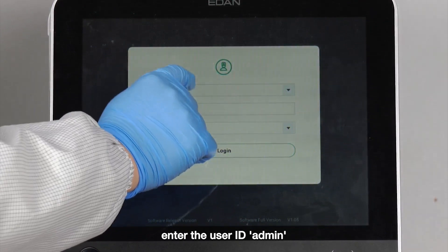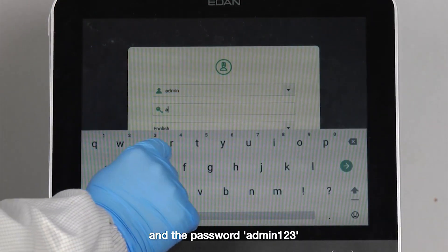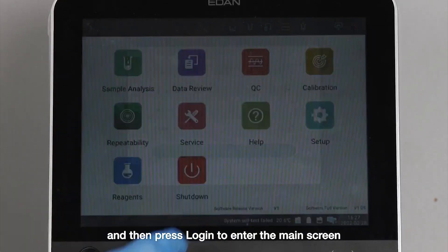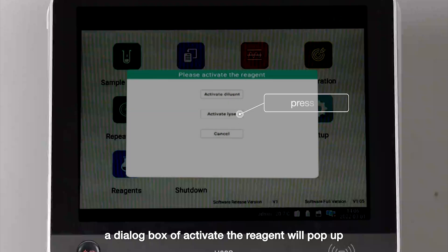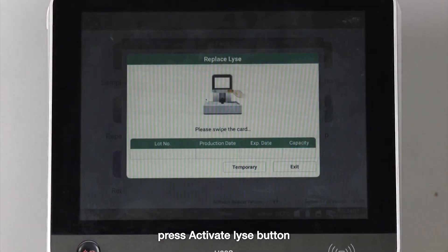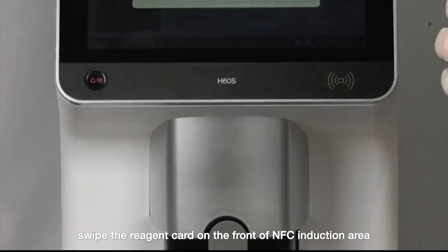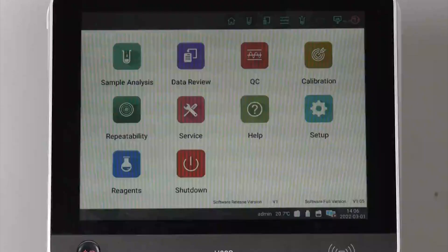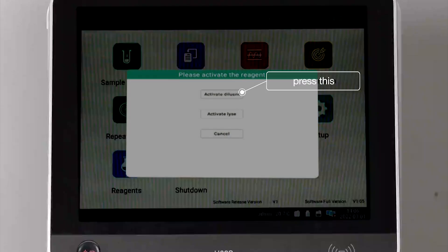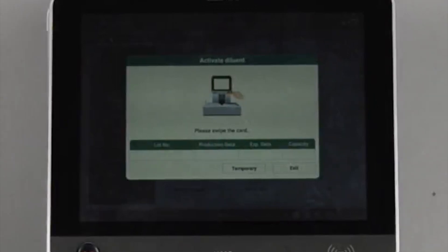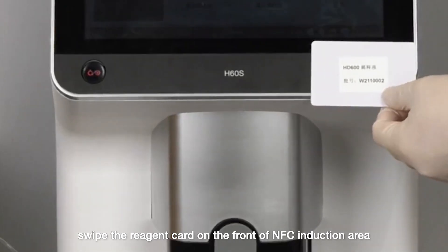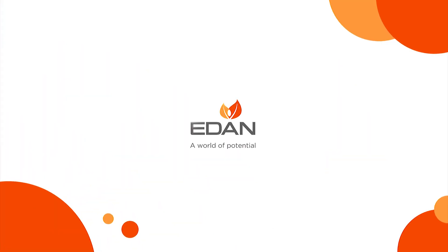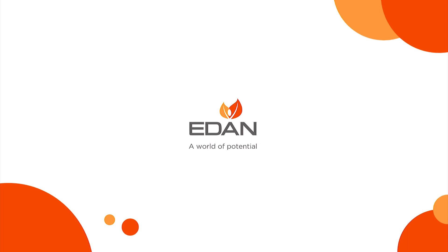Enter the user ID 'admin' and password 'admin123', then press login to enter the main screen. A dialog box to activate the reagent will pop up. Press the activate lyse button, swipe the reagent card on the front NFC induction area, and press start to prime lyse. Then press the activate diluent button, swipe the reagent card on the front NFC induction area, and press start to prime diluent.